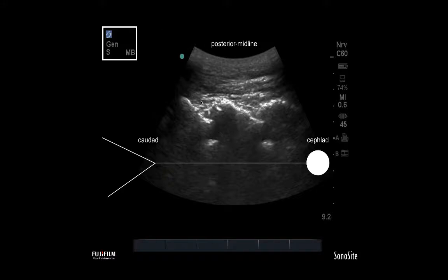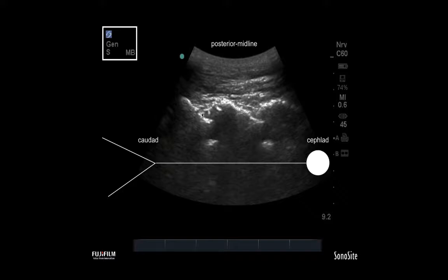Here you see a sagittal scan of the neuraxium, with posterior represented by the top of the screen. The stick figure represents the orientation of the body — head at cephalad, legs down at caudad. You can see a C60 probe being used in the general mode for maximal optimization of these landmarks, and we'll go over what they represent exactly in the next few scans.